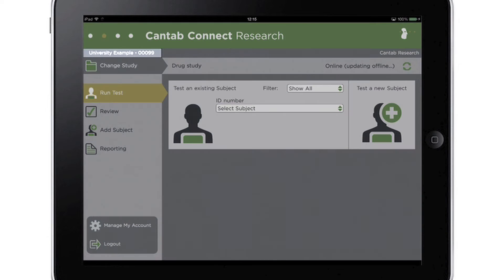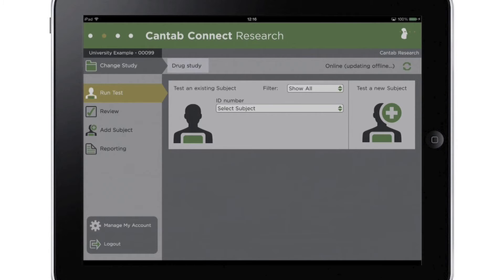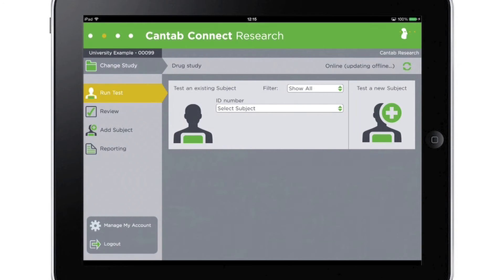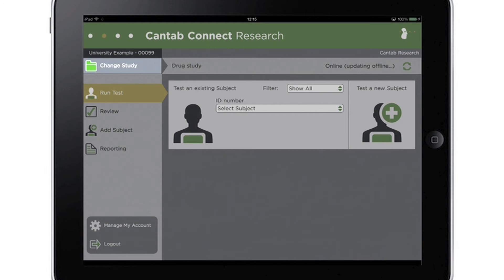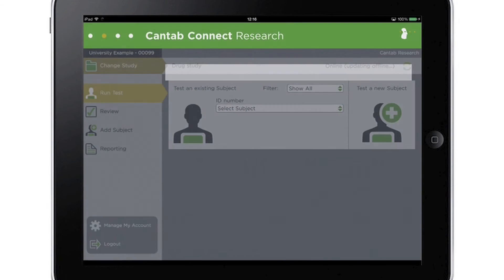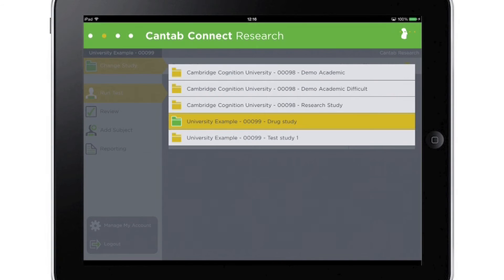When logged in, the organization name will be displayed in this bar and the user's name will be displayed here. The study name will be shown here. If collecting data for more than one study, users can touch here to view active studies and select one to collect data for.